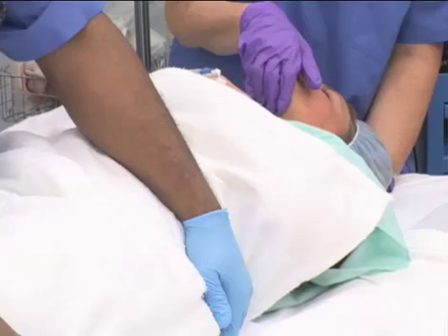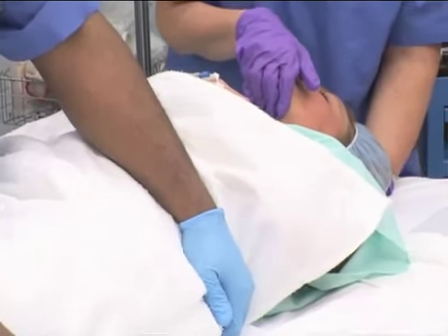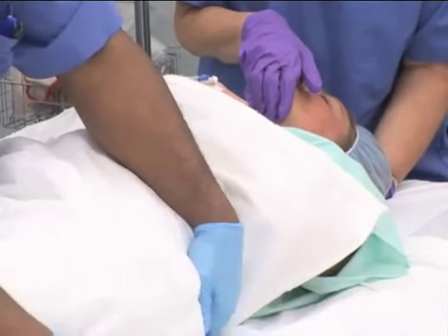The anesthesia care provider guides and directs the move. She remains at the patient's head to protect the airway and prevent injury. Anesthesia, on your go. All right. 1, 2, 3. Okay.